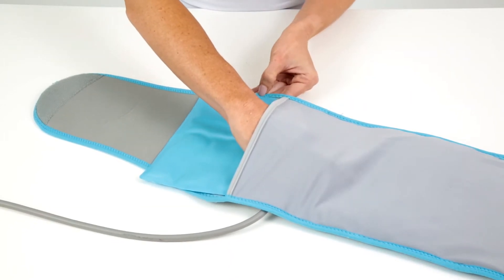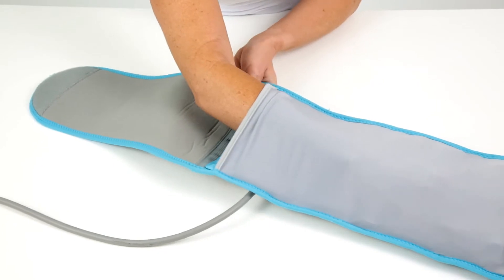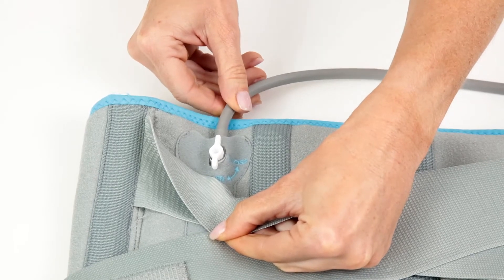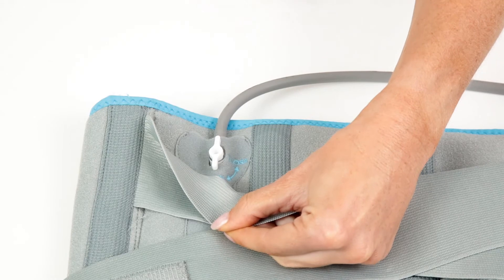First, insert the heated or cooled Arctic Flex gel pack into the pocket of your back brace. Check that the hand pump and hose are attached properly and the air valve is set to the open position before putting on the brace.